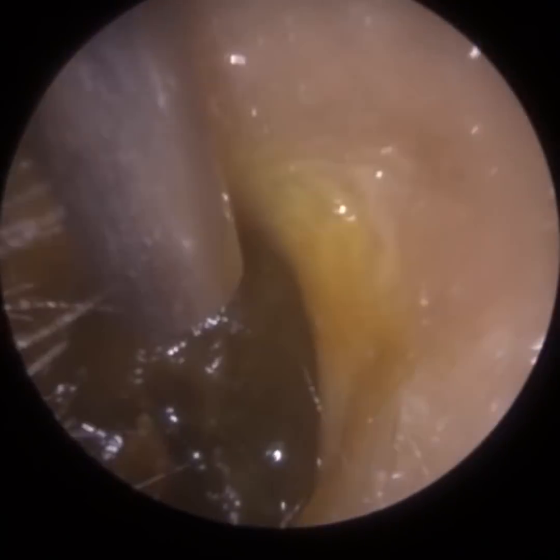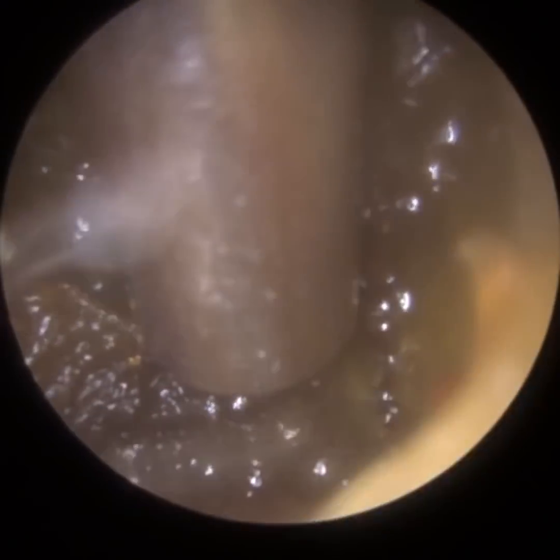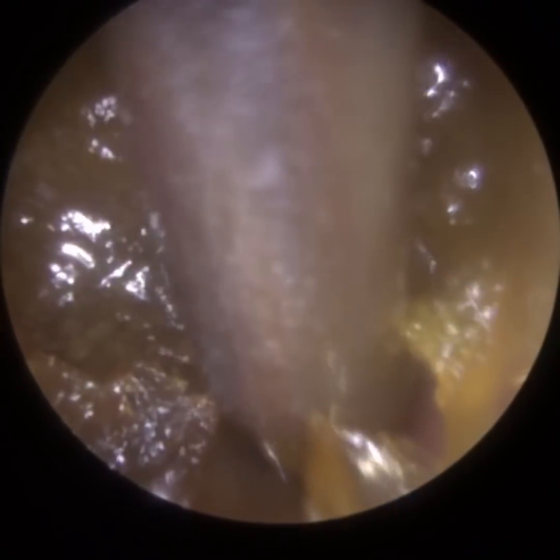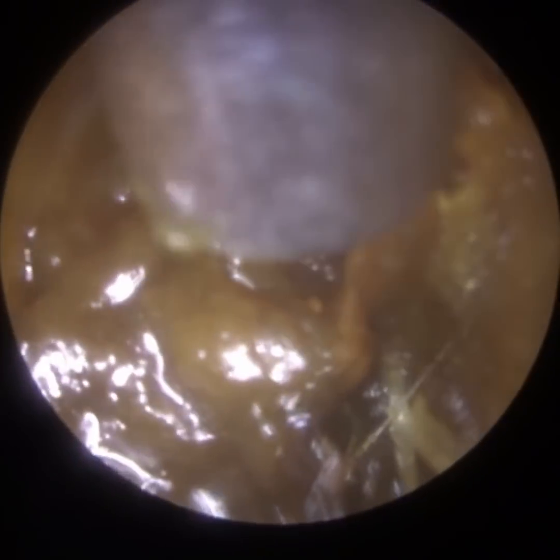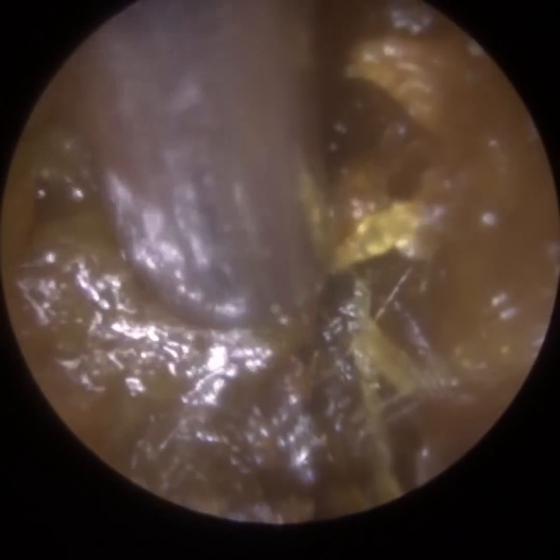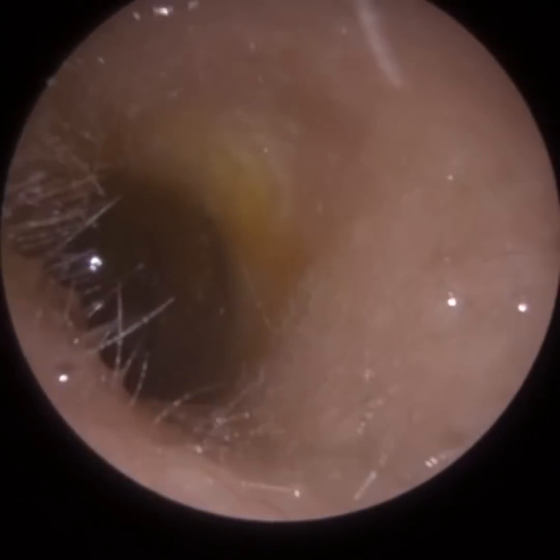It binds the earwax together a bit more, it lubricates the ear canal wall, and it also lubricates the inside of the suction probe. So as the wax is travelling up, as opposed to getting trapped and blocked, the olive oil helps the wax travel through. I had a Clear Wax training course yesterday where we trained three amazing delegates, and I promised them I'd upload this video so I can show them how it's performed.